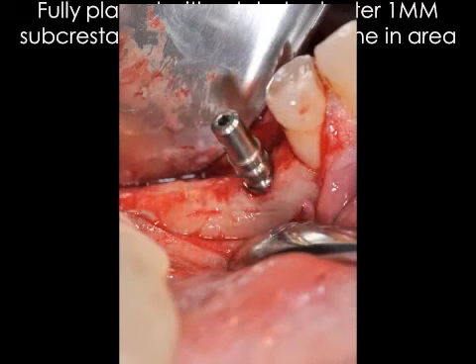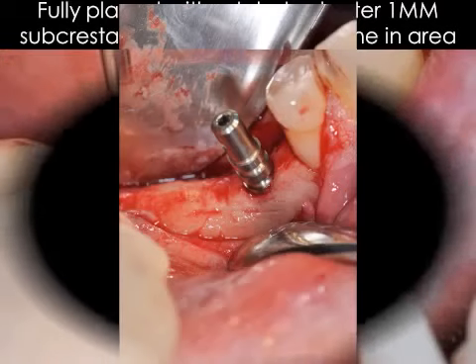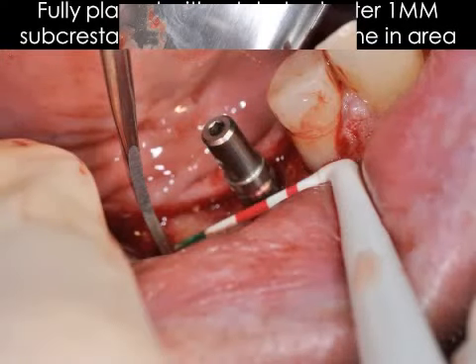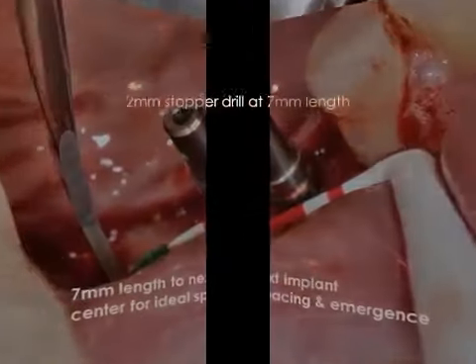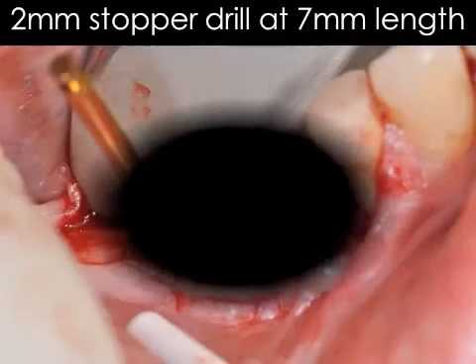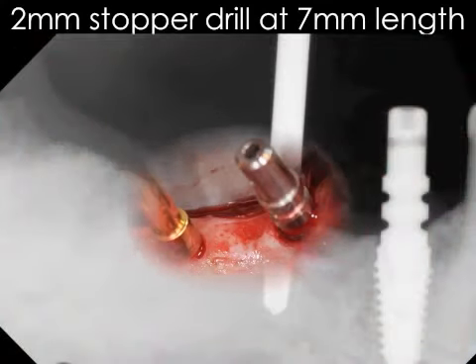And now this is a really nice pathfinder that screws into the implant once your implant is in place. So you can utilize your pathfinder, rather, for a future placement and checking your parallelism at every chance you can. Again, the 2 millimeter stopper drill at what length? 7 millimeter length. Should just note where we are, take an x-ray, and so forth. We're going to proceed with the case.